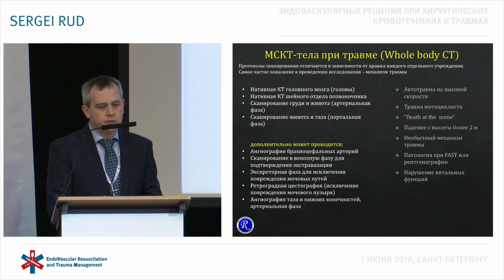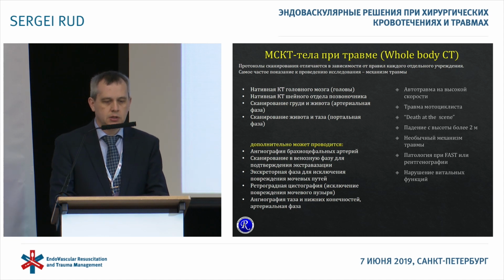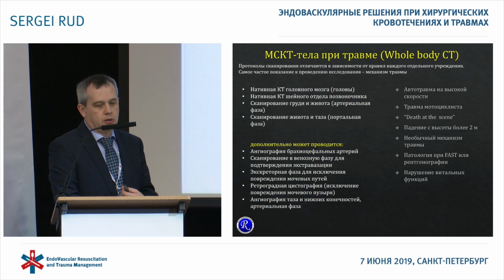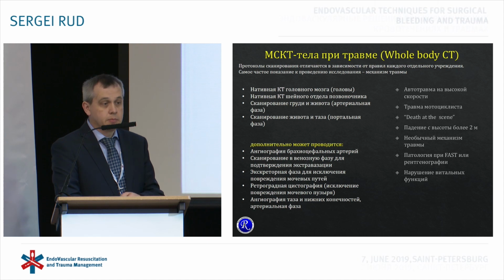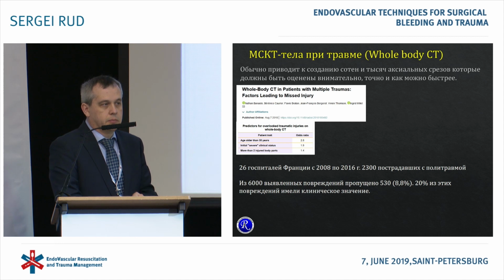And in literature, we now read about MSCT in case of trauma. Usually brain, then the cervical spine, thoracic and abdominal regions, and pelvic region with abdomen are studied. In addition, angio may be added of brachiocephalic arteries, venous phase in order to confirm extravasation and others. Usually, the damages of these areas may be caused by trauma.